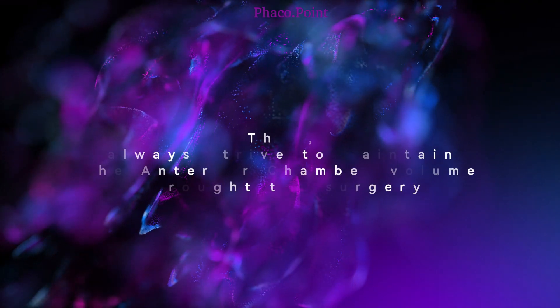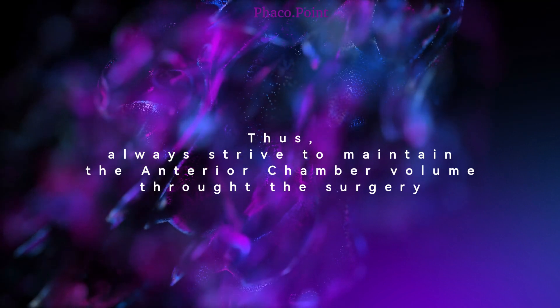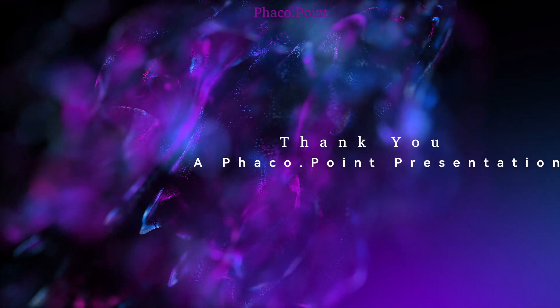In the manner just demonstrated, right from making the incisions up to the point of hydrating the last side port, the anterior chamber volume should always be consistently maintained. I hope you found this tutorial useful. Thank you.